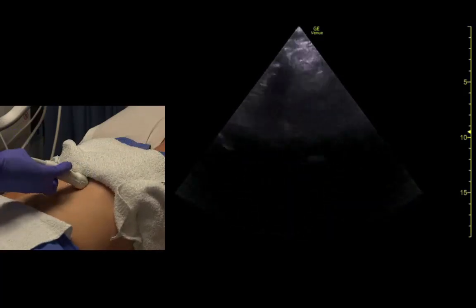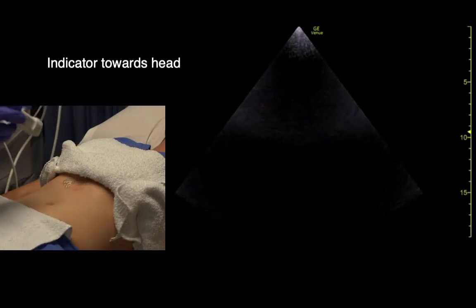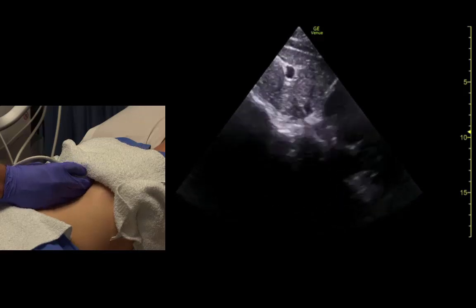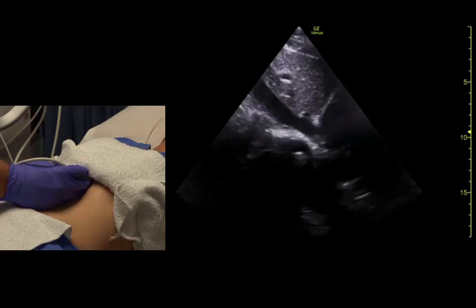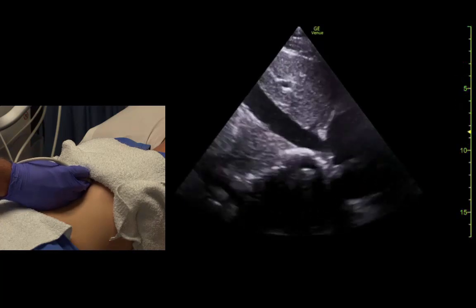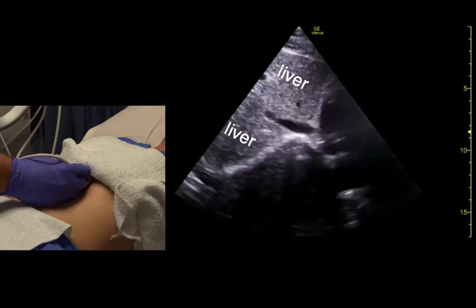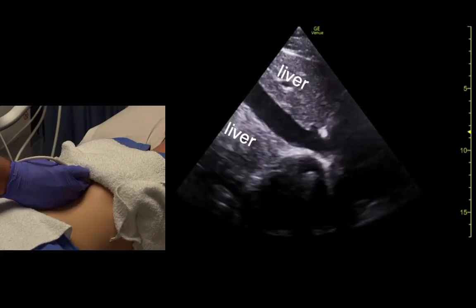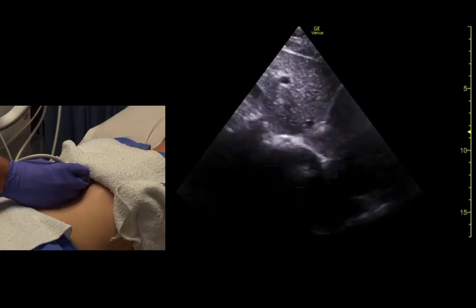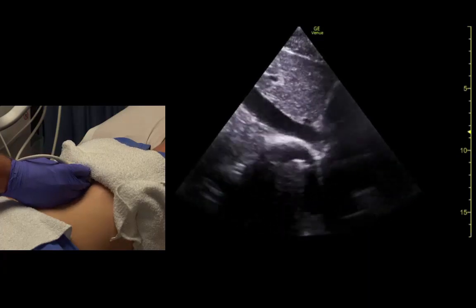A lot of times we'll also do the IVC view from this position. We get into that same starting position with the indicator towards the head, rock up until we see the heart, and angle slightly sideways. We can then see the IVC entering the right atrium and observe how it changes shape with respiration. The aorta is right there alongside the IVC.